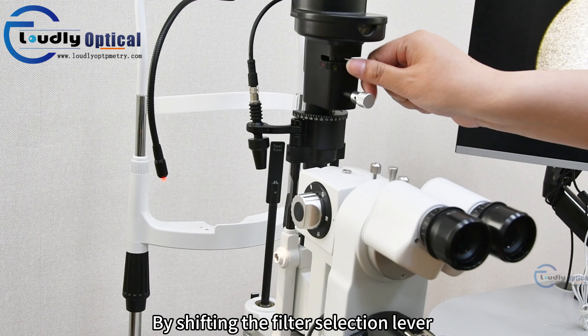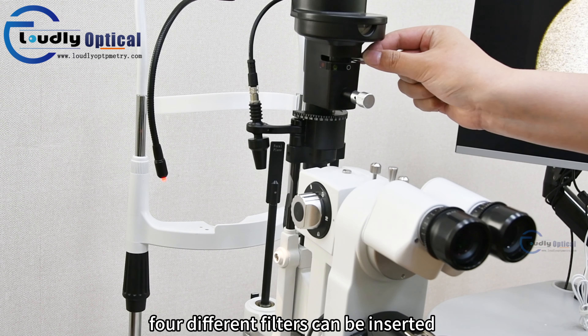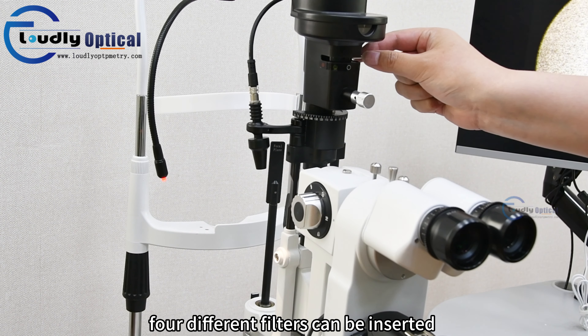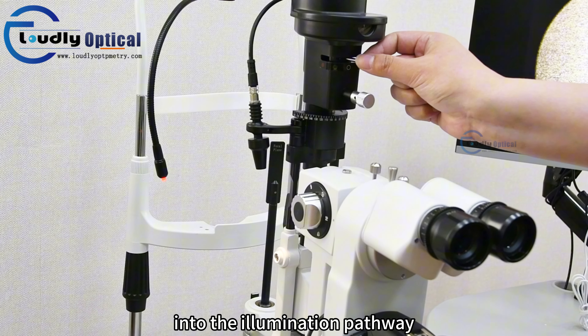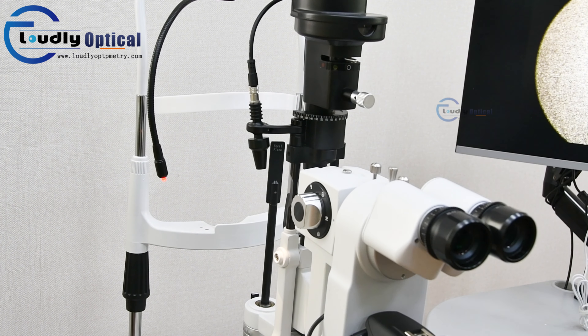By shifting the filter selection lever, four different filters can be inserted into the illumination pathway.